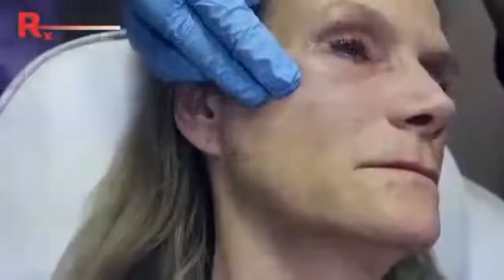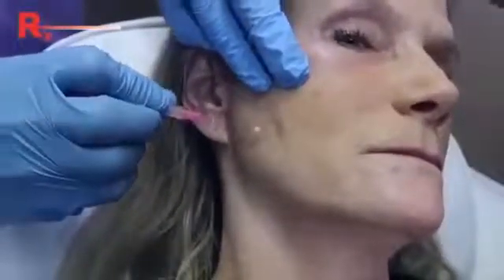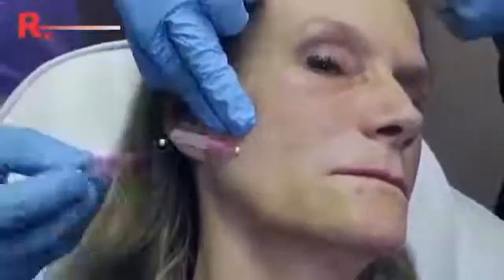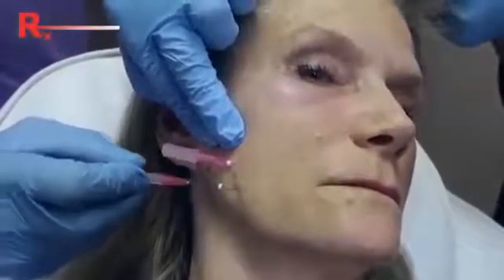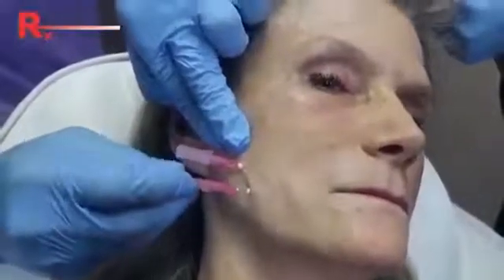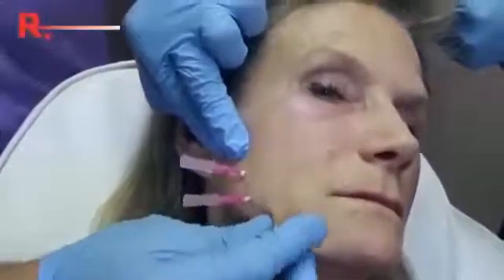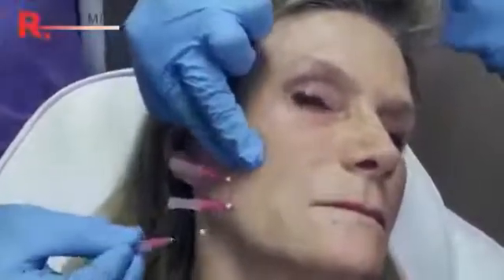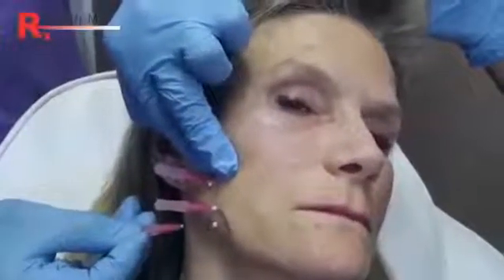And I'm going to mesh several threads through here. So we know where one was, and we just are creating a structural support. These threads will dissolve in about 4 to 6 months, and they'll leave collagen behind in a mesh-like fashion so that when she does smile, these lines won't be showing as an extreme crease as they are now, and in that sense they're going to fade.